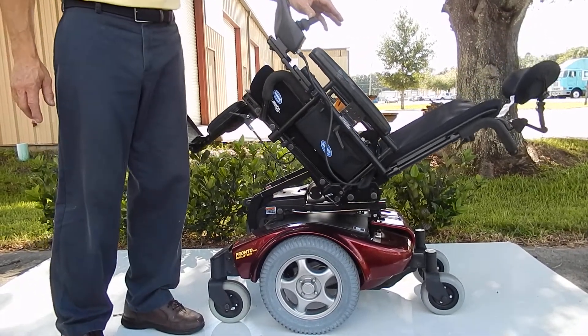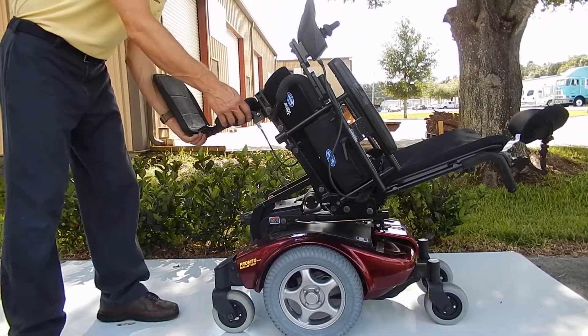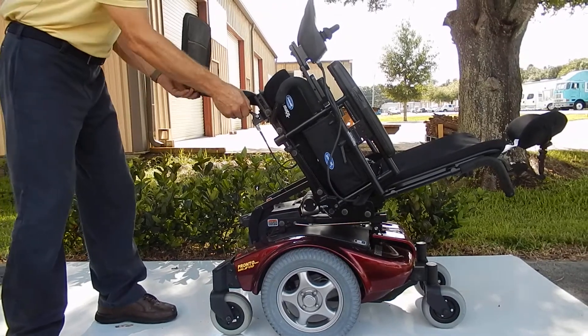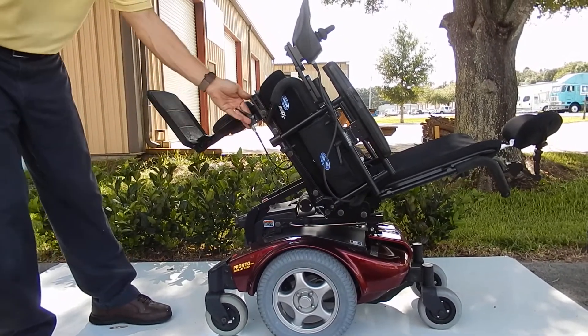This chair also has manual legs, so these legs can be adjusted manually. There's a lever here. You pull it up, and you can put it at any level you want to. There are manual legs with this lever.